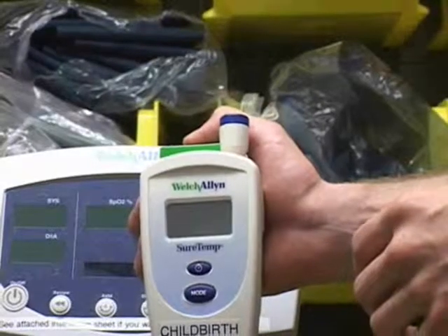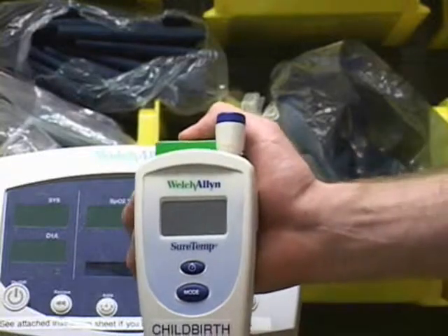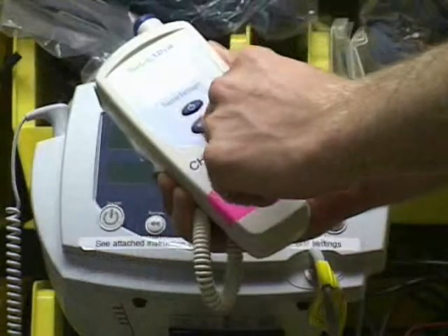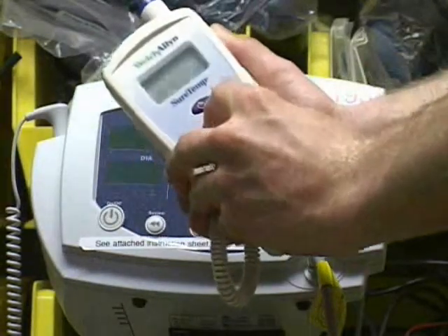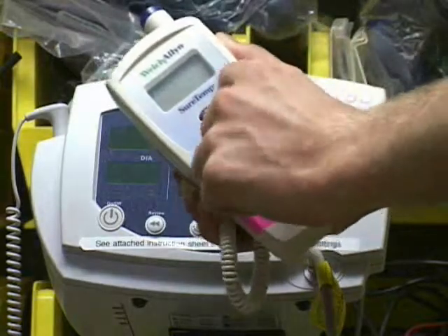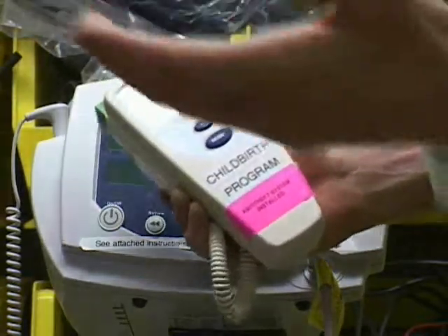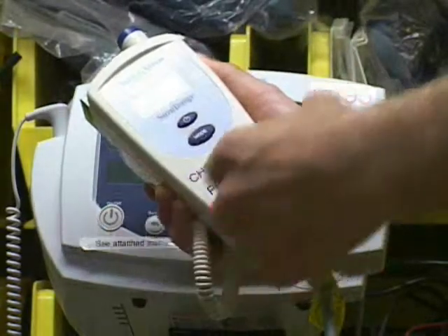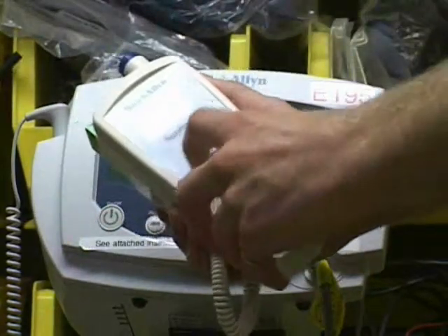This is a point-of-care testing thermometer. We are going to do a quick demonstration of how virtual buttons might be applied to a device like this. The problem with mechanical buttons like this is that they allow grime and dirt to hide in the crevices. This becomes a breeding ground for nosocomial infections, and superbugs can hide and grow in these crevices. It is extremely hard to sterilize such mechanical buttons.